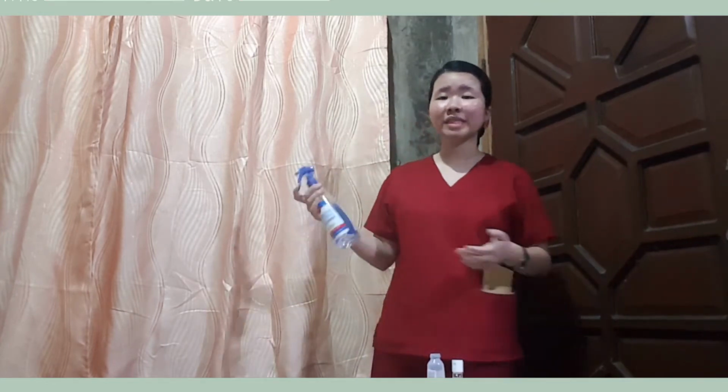For the next procedure, you need to wash your hands. Since I already washed my hands, I am now applying an alcohol-based hand rub to prevent the spread of contamination or microorganisms. For procedure number 4, prepare, gather the supplies, and check medication, regular and intermediate insulin from the refrigerator.